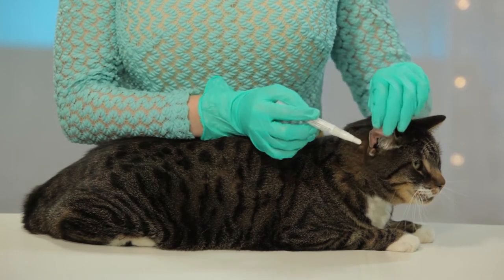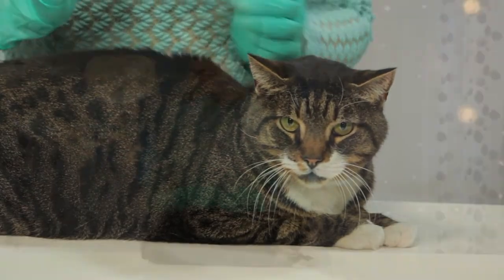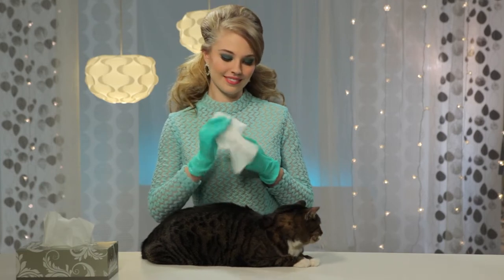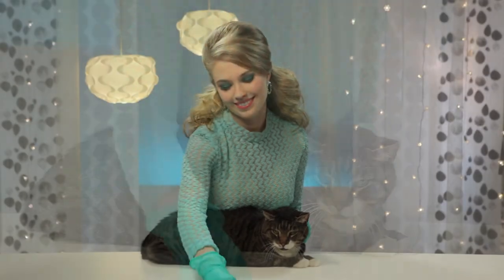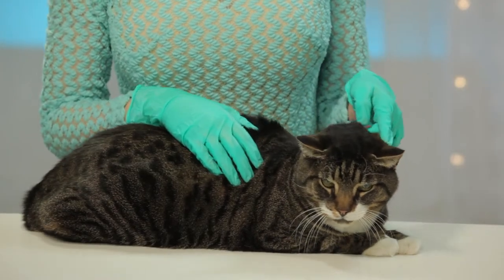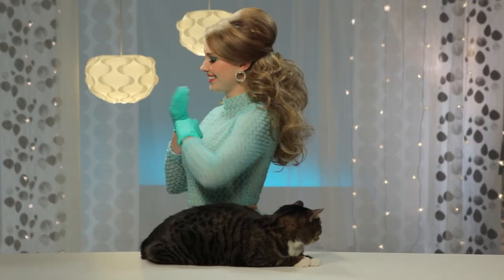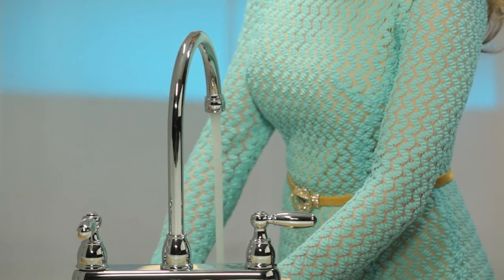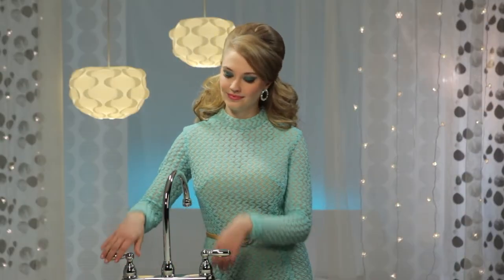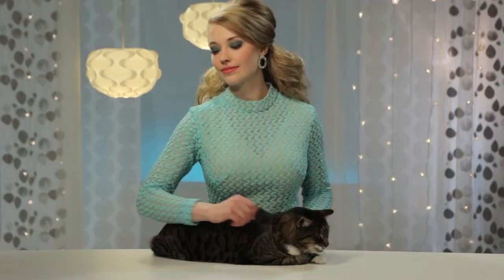Now Meow Meow can go back to doing what she was doing — probably napping, right Lucy? Just wipe the tip of the Twisted Dose applicator with another tissue and throw away the tissue. Replace the cap and you're ready for the next application. When it's time, put it on your cat's other ear — alternate ears with every dose. Oh, and Lucy, you can take off those gloves and throw them away.